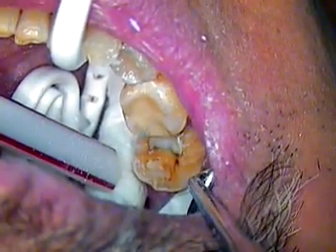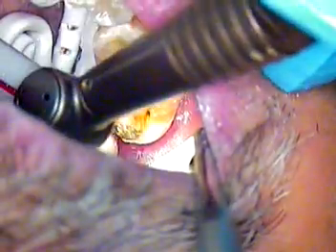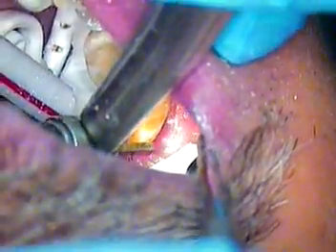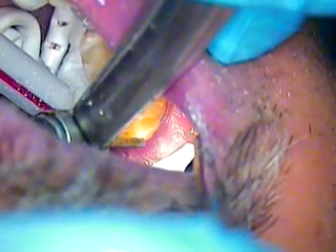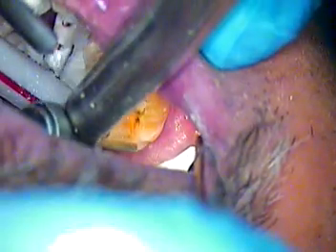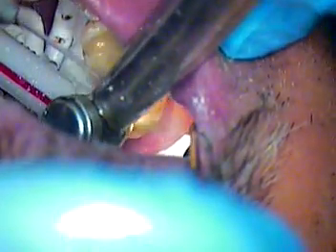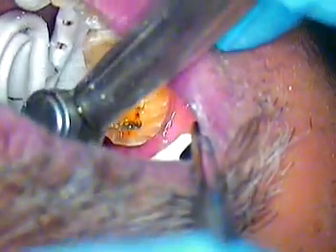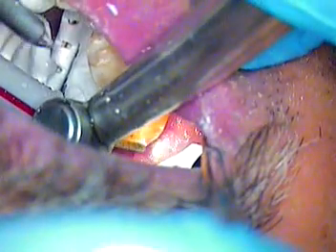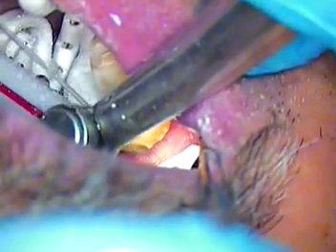It's going to bring our patient up a little bit. Now I'm going to run a little water with this part of our procedure. Alright, so now it's just a matter of connecting the dots. I'll just take it all the way around to the distal, and I'll do a depth cut back there. Now connect the dots.